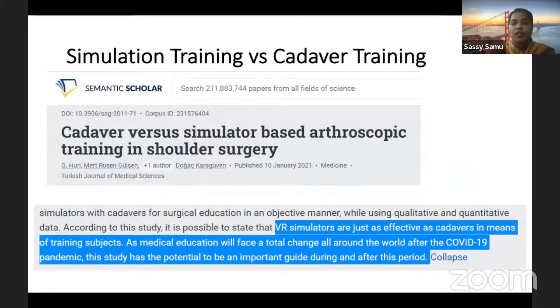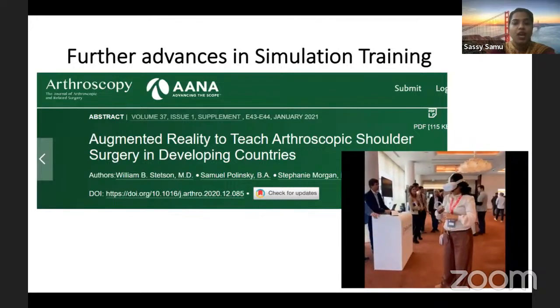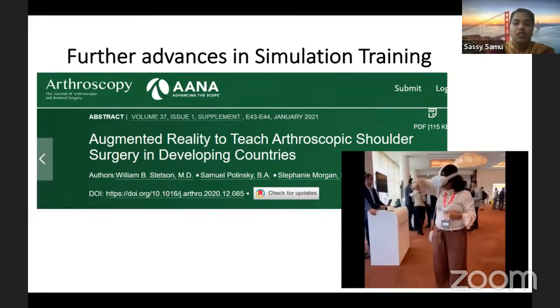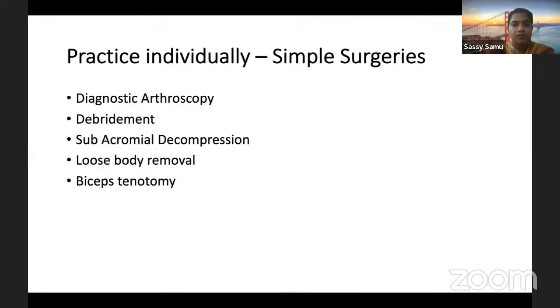And comparing cadaver versus simulation-based arthroscopic training, simulator training helps us to reduce the learning curve and also to perform better in cadaver labs rather than going directly into the cadaver labs. And you can do these surgical steps as many times as you need until you master them.